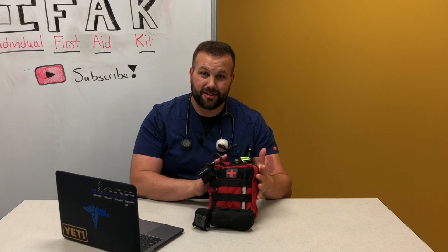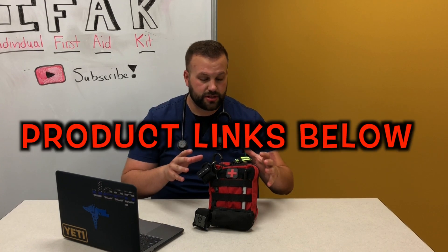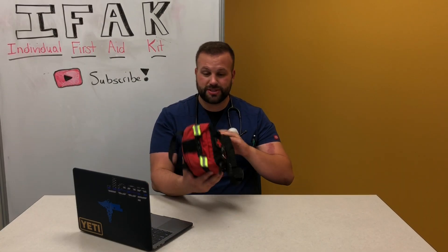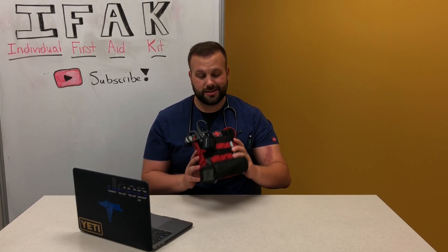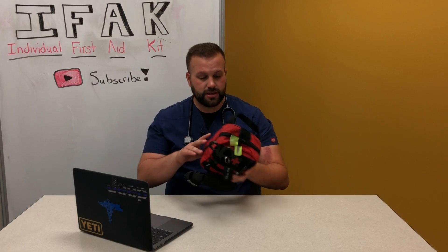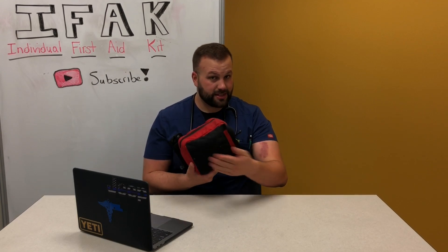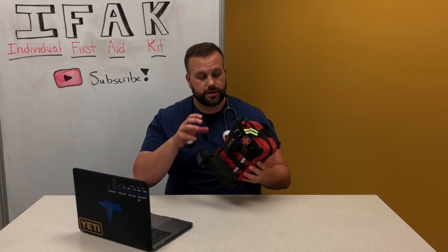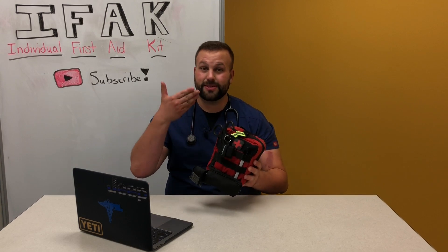By making your own IFAK you'll know what you're putting in there, where it is, and how to use it — hopefully. The majority of the content in this IFAK can be bought on Amazon — I'm not affiliated with any of these companies, it's just what I choose to run. So first off, let's take a look at this pouch. It's a great portable size, it's red which gives away that it's a first aid pack, it's got a velcro backing so you can attach it to just about anything, and it's got a MOLLE platform on the front so you can attach essential items you need to access quickly without opening the pouch itself.